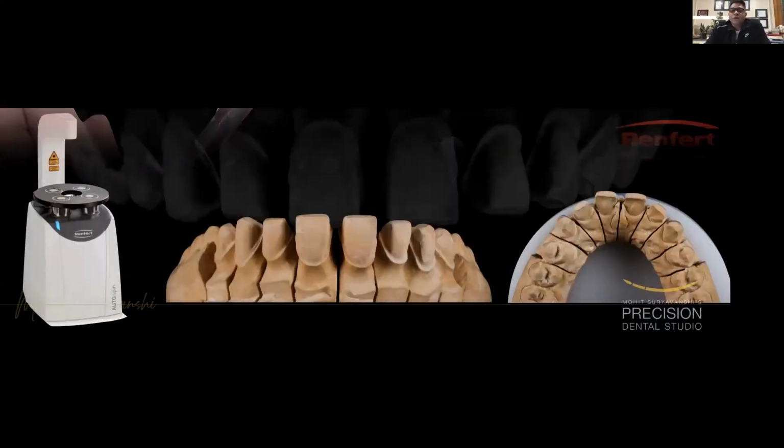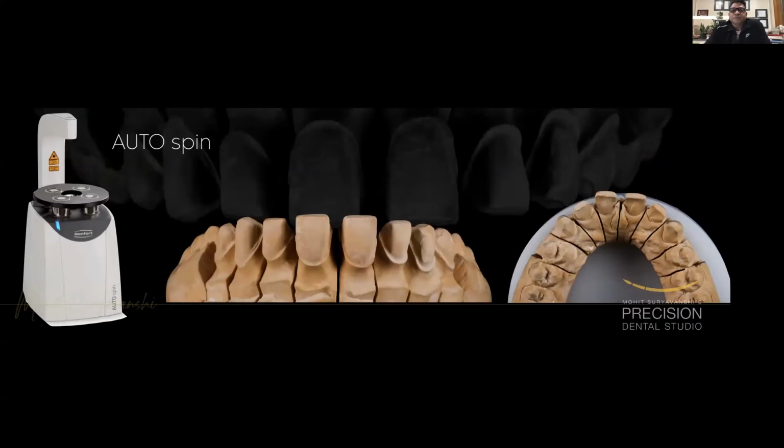And that's how a model has been made. Every detail has been perfectly registered. Then the ditching has been carried out. Even though there is a veneer, if it's a crown, we make sure there is a split model that has been made.